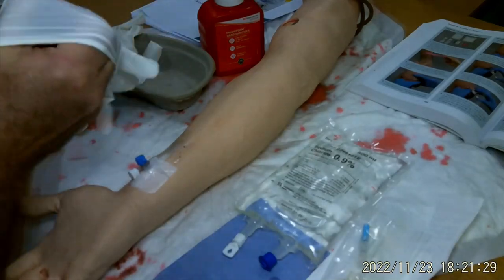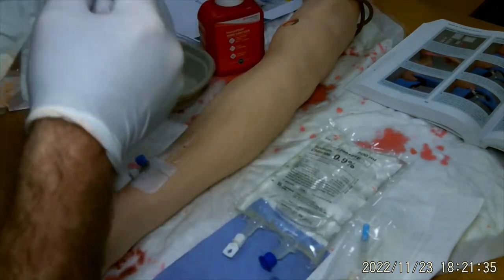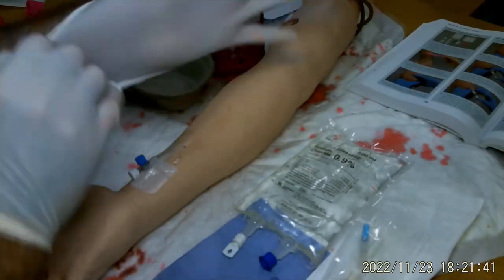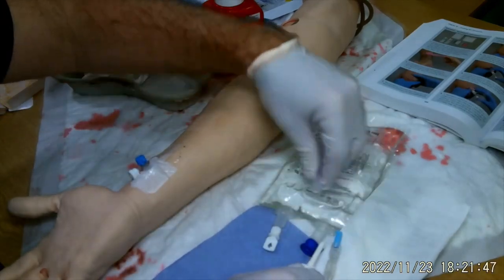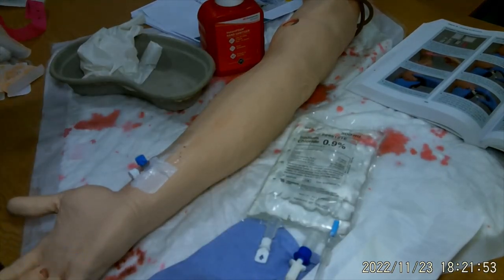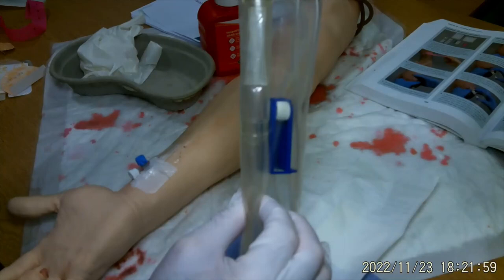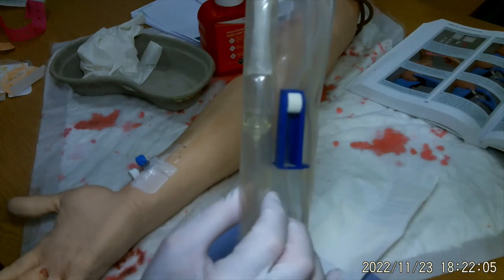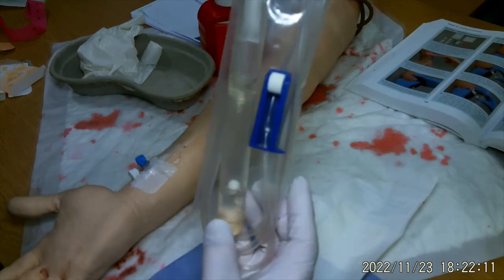I'm now going to pop some gloves on so that I can remove the sheath from the sharp, and then the sharp can go straight into the outlet port. My wheel's locked off — there's my port. The sheath comes off and goes straight into the port. Being a key site, we don't want to touch anything there. I'm now going to hang this up and gently squeeze the bottom chamber twice. The gentler we do it, the less likely we are to get any bubbles. Twice, maybe three times, but that looks enough — let it settle.